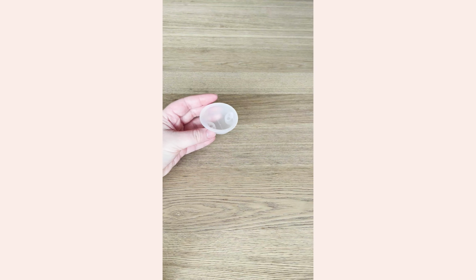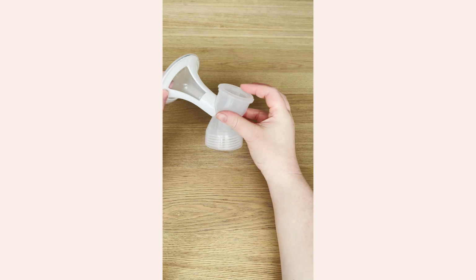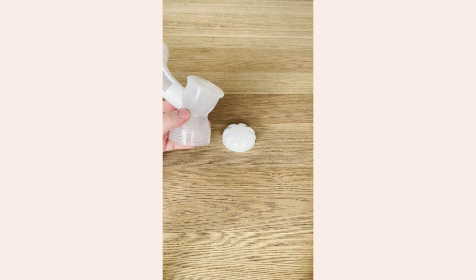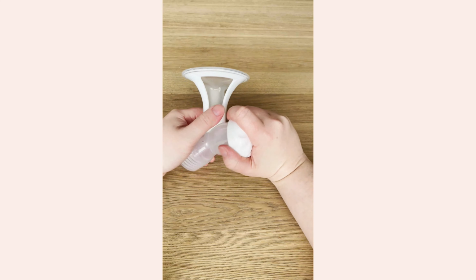Check over your diaphragm cup for any tears and then place it into the body, ensuring that it is sitting flat. Grab your cap, push it down and twist firmly into place. It should not be loose.